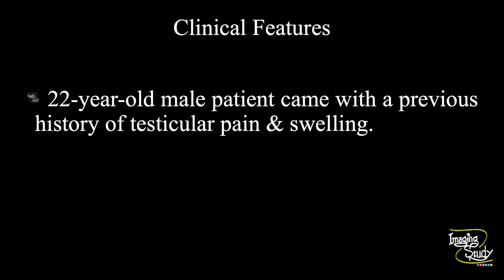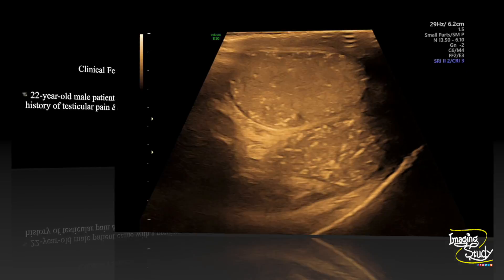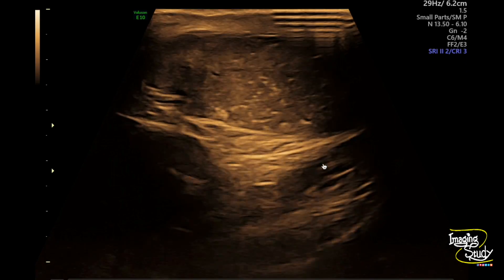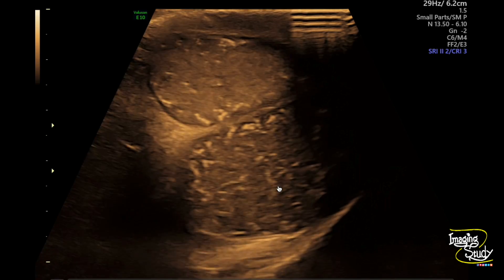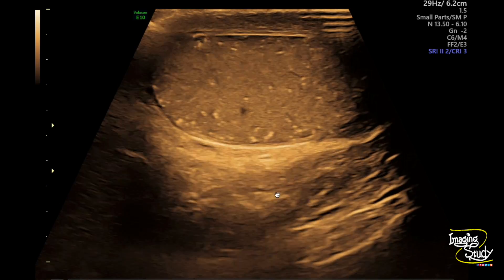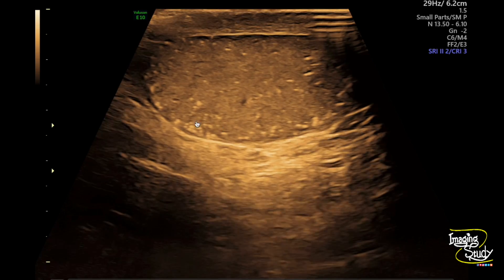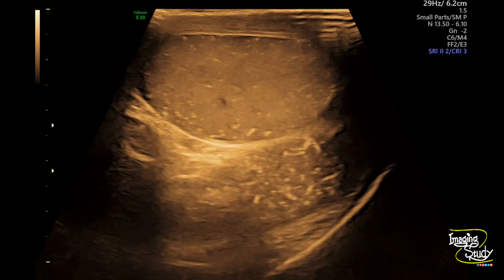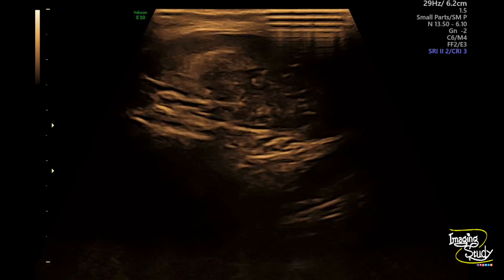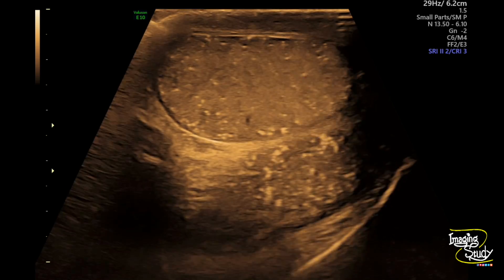Let's see what we have got on ultrasound. Here you can see the long section of the right testis, and you can also see the glimpse of the left testis, where tiny echogenic foci casting comet tail artifacts are seen throughout the parenchyma. On a single field of view, the number is more than 10, so this is a diffuse variety of microlithiasis.